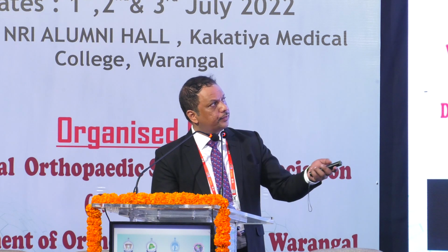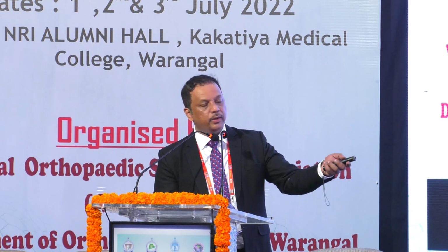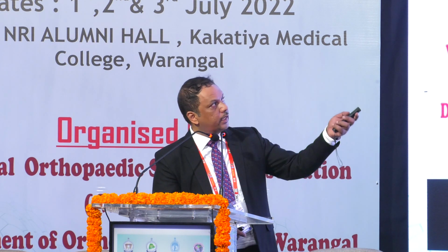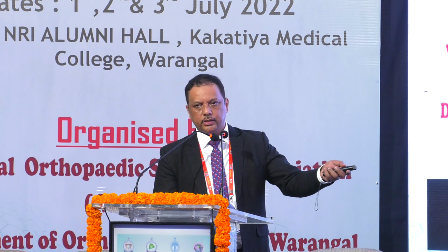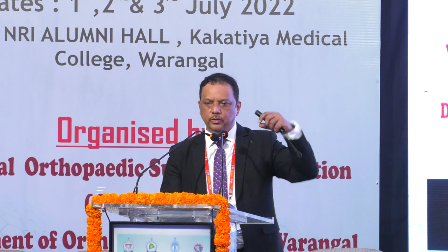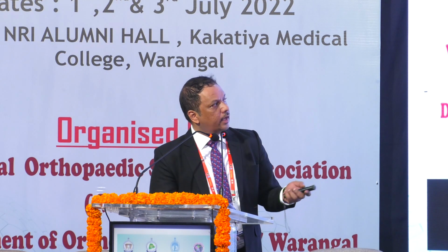If at all you have to open or you do a Kapandji kind of technique, you can use these basic techniques where you can use an osteotome to elevate the fragment to get your volar tilt or even your radial height or length. That's very crucial for us to get back the mechanics. So rarely done, but whenever we do an open reduction this could be useful, but otherwise you can use a Kapandji technique and use the K-wire itself as a joystick.